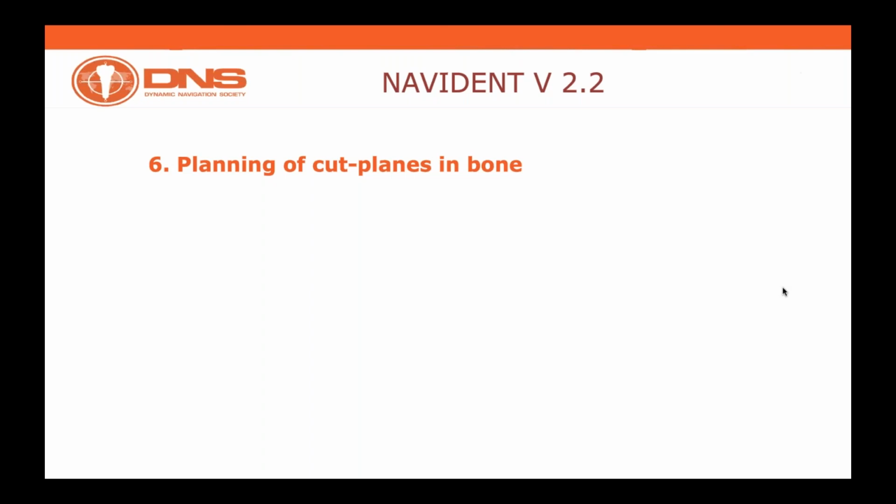And if we can not only do that, because we already know for sure that we can achieve it using Navident, because Navident enables piezo activity, but if you can also do it from an assessment standpoint, that would be equally important, because it will enable us to improve the surgeries up to a level which is most satisfactory for the patient, who is ultimately the beneficiary of the surgery and our endeavors. So that is the question.